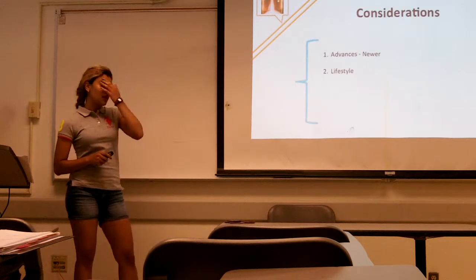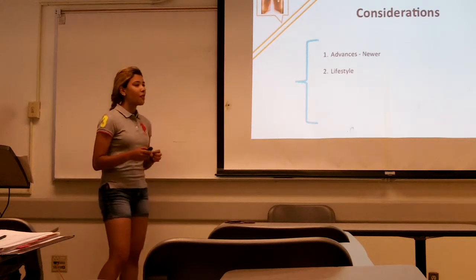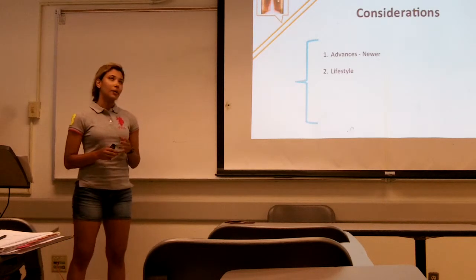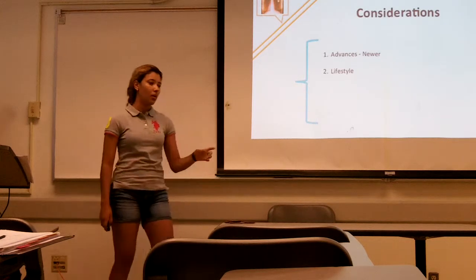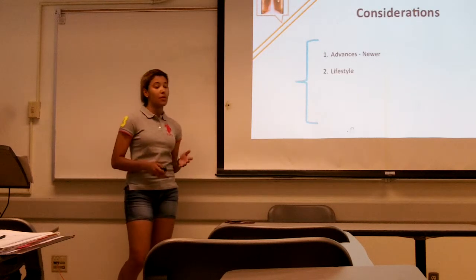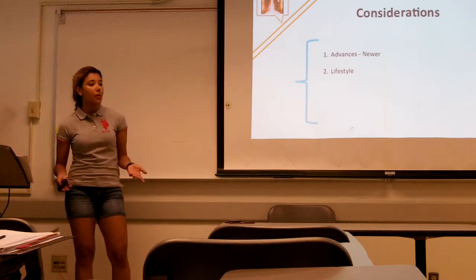The lifestyle of the patient is so important because the patient needs to avoid contact with magnetic fields, for example, small things like cell phones or MP3 players. In the house, household appliances like the microwave oven, or unusual things like metal detectors in airports.